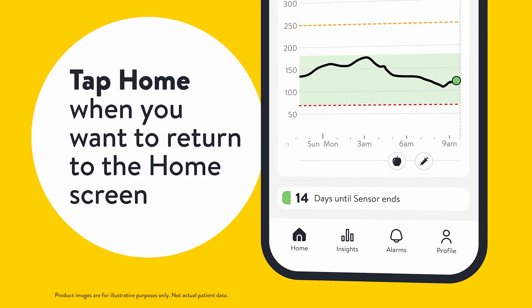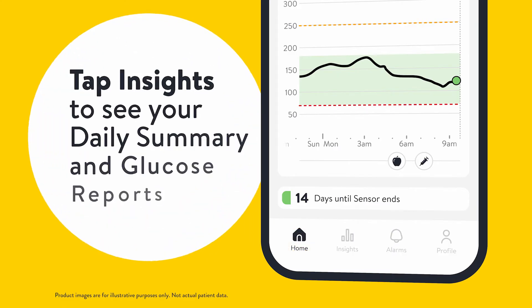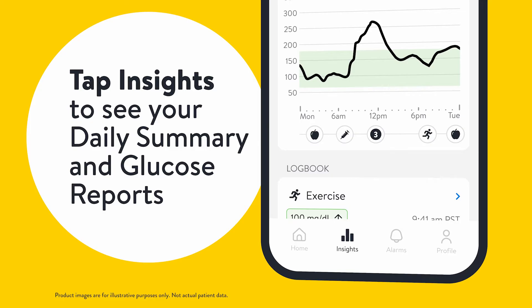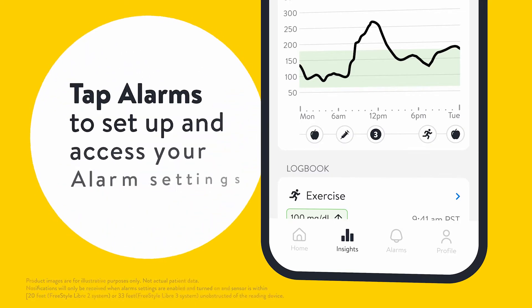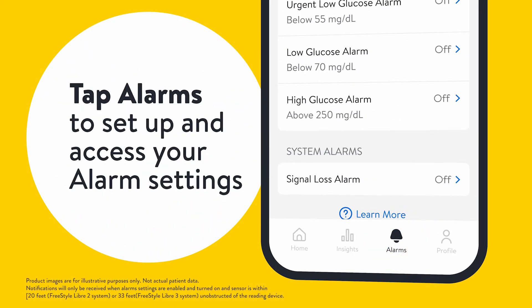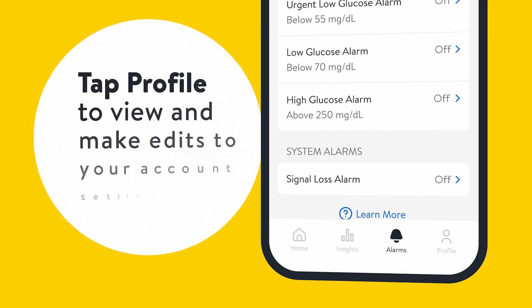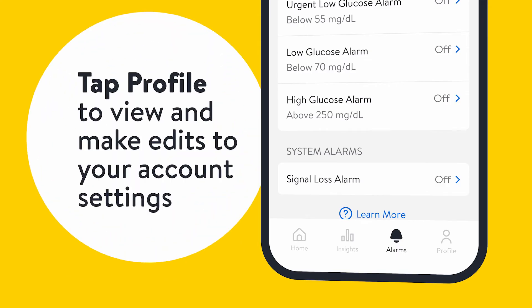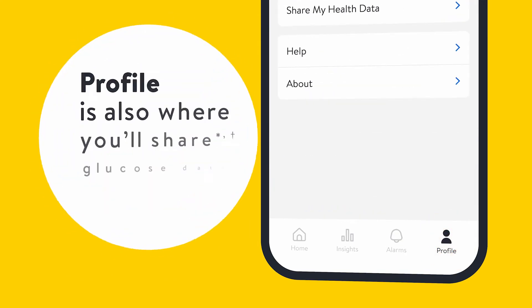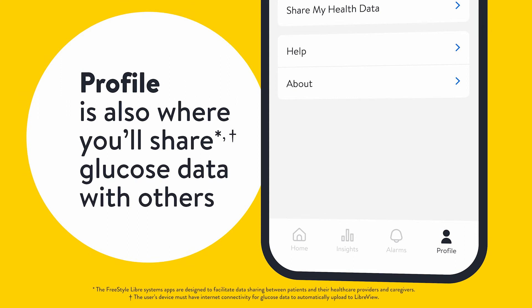Tap home when you want to return to the home screen. Tap insights to see your daily summary and glucose reports. Tap alarms to set up and access your alarm settings. Tap profile to view and make edits to your account settings. Profile is also where you'll share glucose data with others.